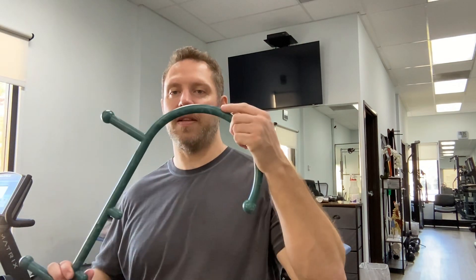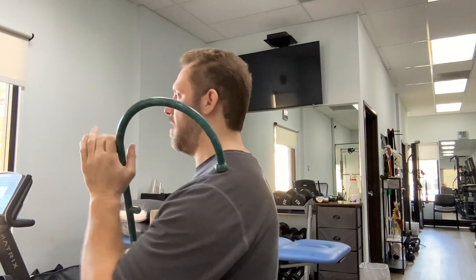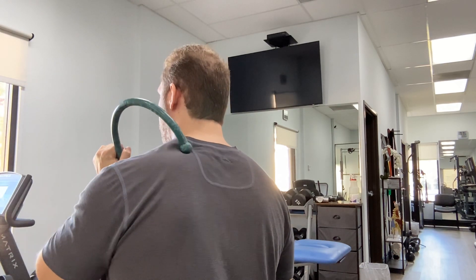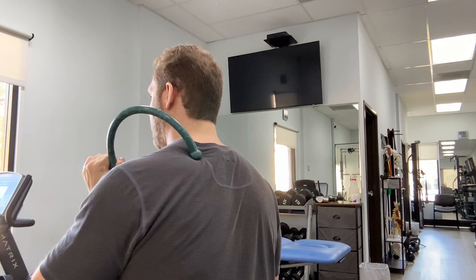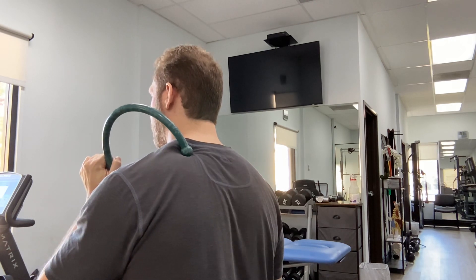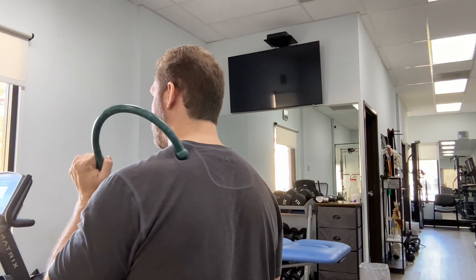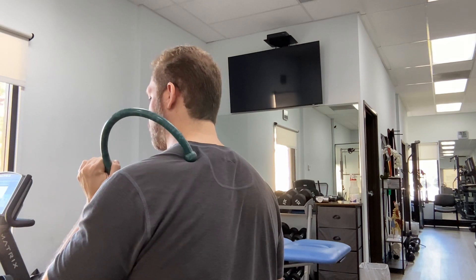I'm going to be demonstrating several soft tissue techniques for the neck and the tricep. The first one I want to use is the Theracane, on the upper trap and levator. You want to pinpoint the tip of the Theracane and kind of push down, moving back and forth with a very small movement, tracing down the slope of the shoulder.